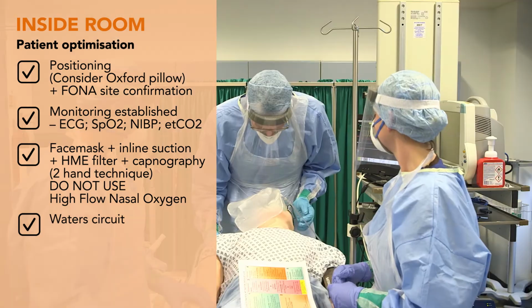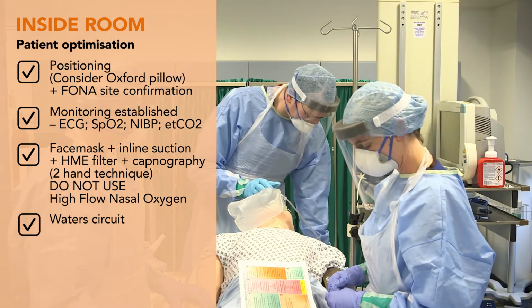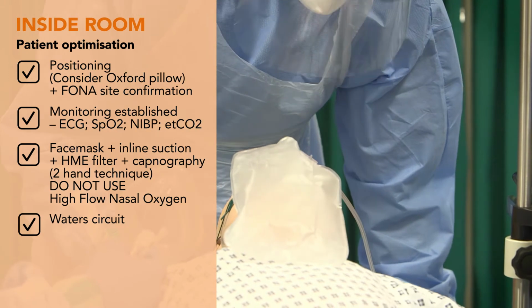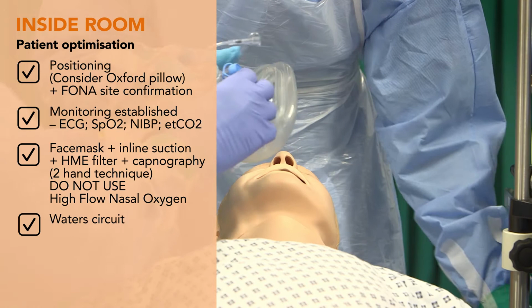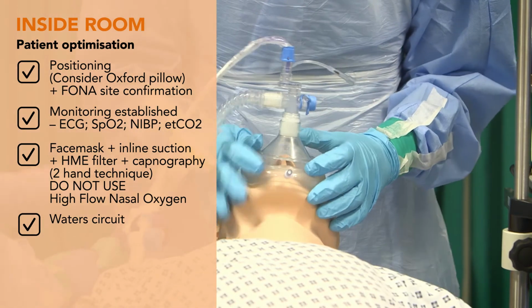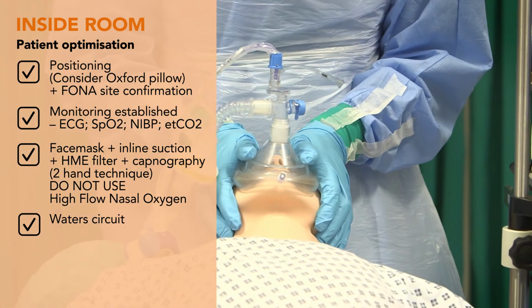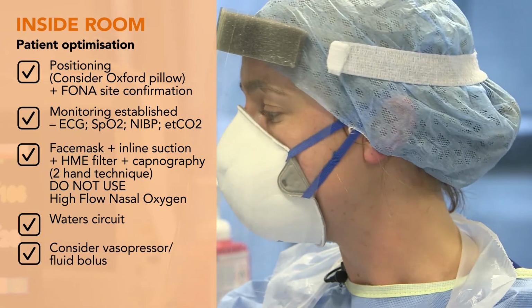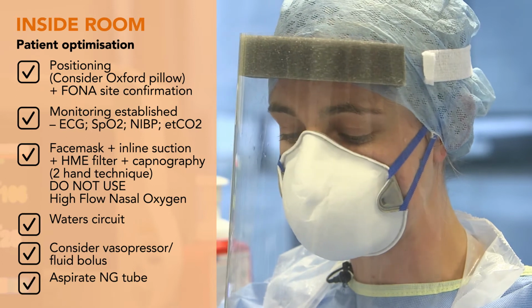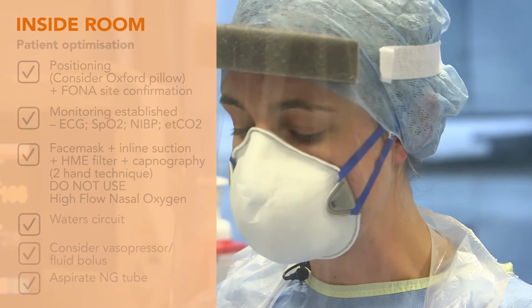I'm just going to switch this mask over now, sir. So I'm going to turn off the oxygen to the non-rebreathe mask just to minimise aerosolization, and replace it with the face mask, which I'm going to secure with 2 hands. So we're going to consider a vasopressor and fluid bolus if needed, and aspirate an NG tube if there is one. So now we're going to go on to our pre-intubation check.